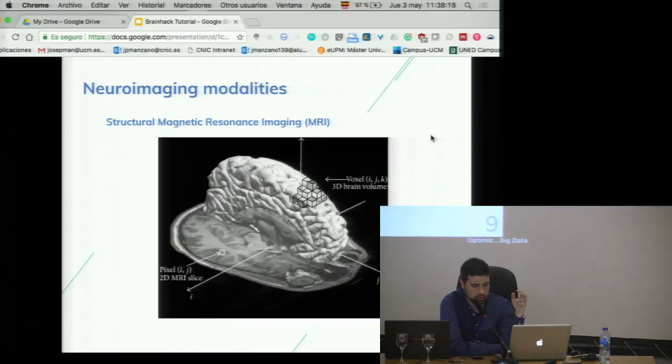And the way you handle this data can be really susceptible to errors, because as I will show later, an MRI scanner is not something that always produces the same result. It can change a lot. Even the same patient, two acquisitions on different days, can produce super different results. And that's because there is a huge problem with the signal-to-noise ratio of these kinds of scanners. And as I said, since the scanners are really expensive, hospitals cannot have the latest. It's very common that you will go to a hospital and get an MRI scan of your knee, and they will probably use a scanner from the, well, not the 90s, but almost.